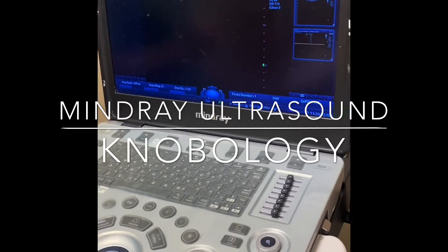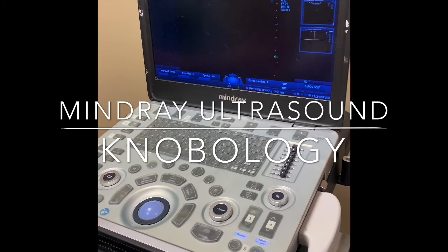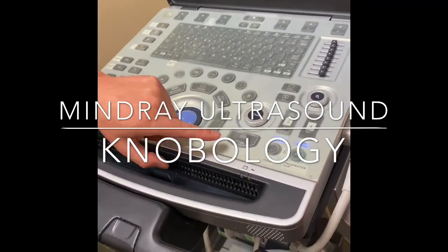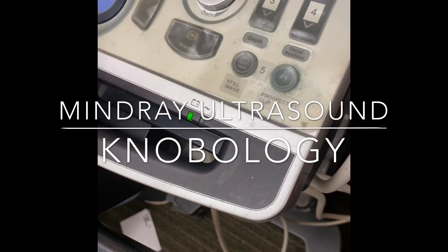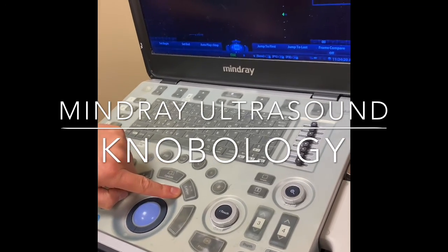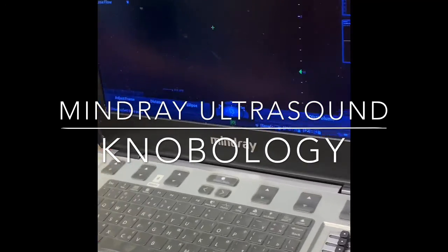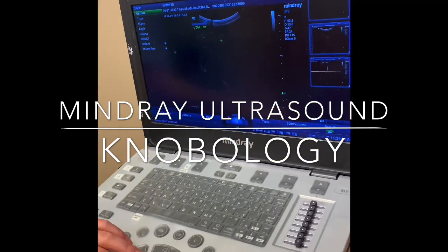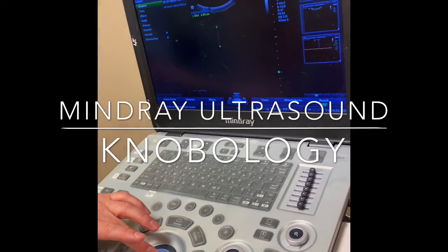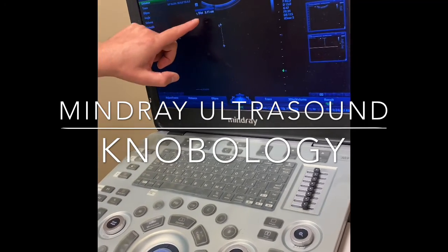Now, one more thing to talk about is making measurements. For example, if you want to measure the size of the aorta, the size of the gallbladder wall, what you would need to do is press freeze once you have the object you want in view, and you press the caliper button. When you press caliper, you see the set of calipers pop up. I move this around to where I want it, I click, and then a second one appears to make the second measurement.